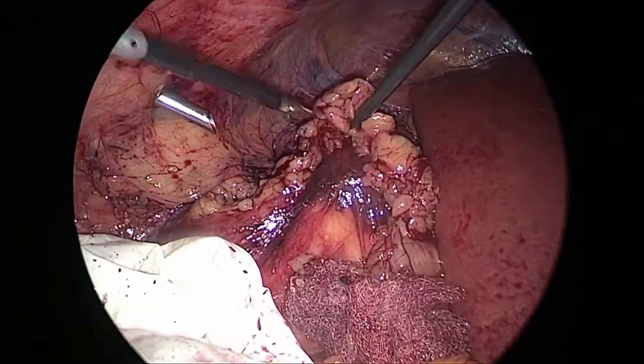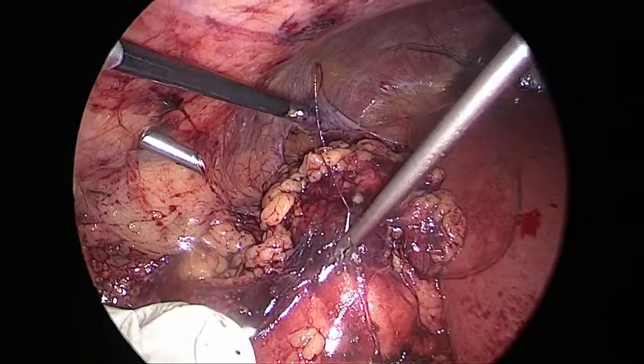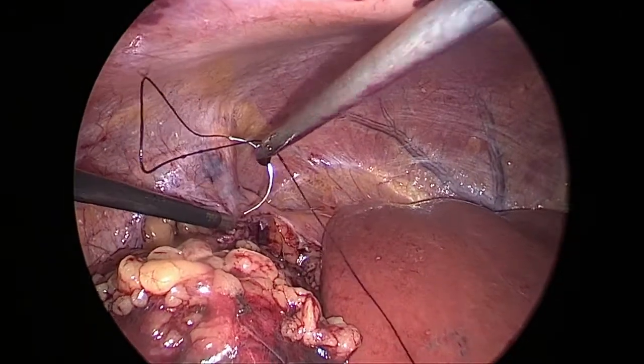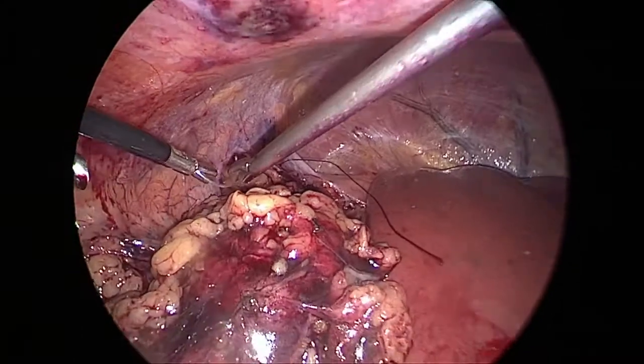One thing is important, if it is possible to cover the kidney with the Gerota fascia, it is always better to cover it with Gerota's fascia. I am covering the kidney with the Gerota fascia, putting a stitch.